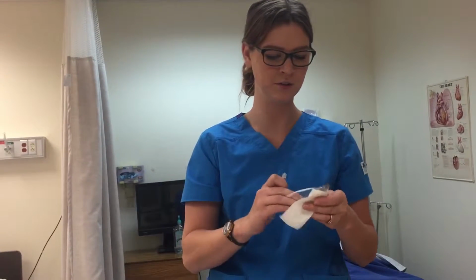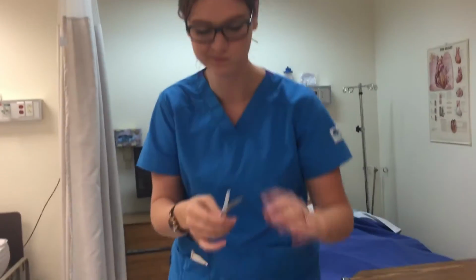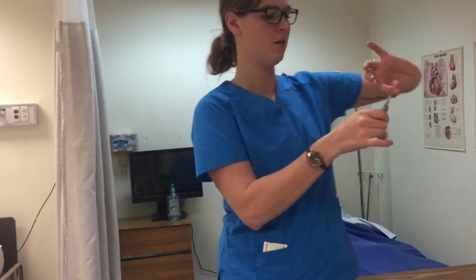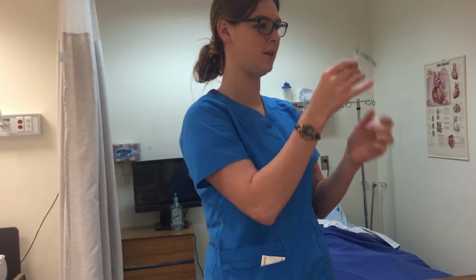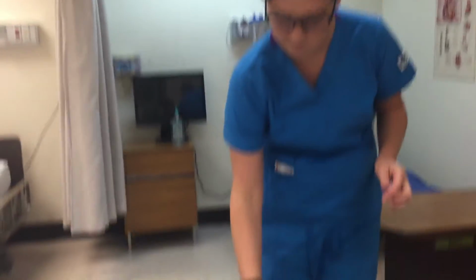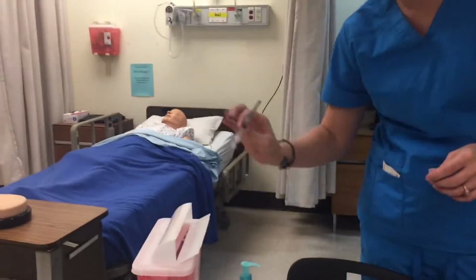Because you don't want to use a filtered needle on a patient. There could be bits of glass in that. That's the whole purpose of the filter. Move the safety out of the way, remove the cap, air bubbles are up, prime the needle. And that is how I would prepare a glass ampule. When I'm done, always put the safety on and it goes into the sharps container.